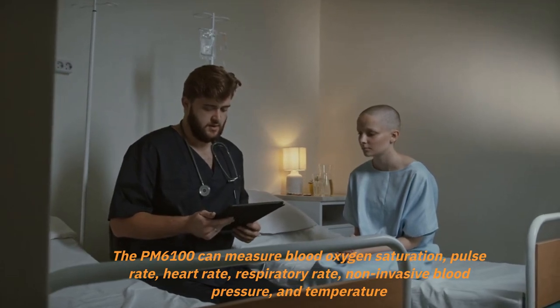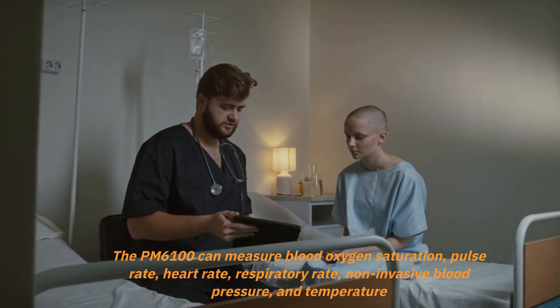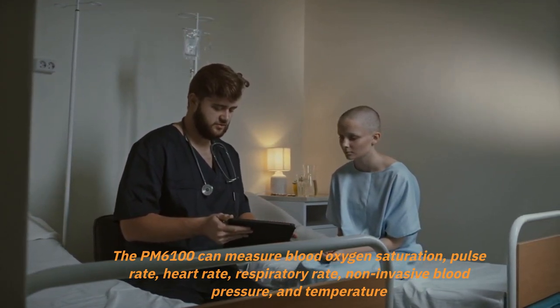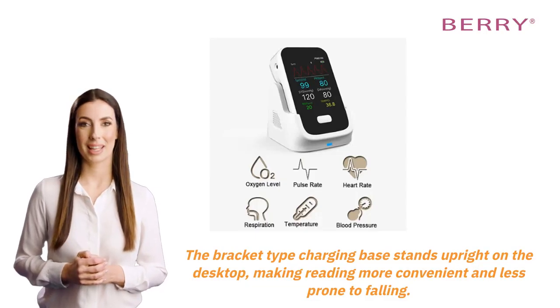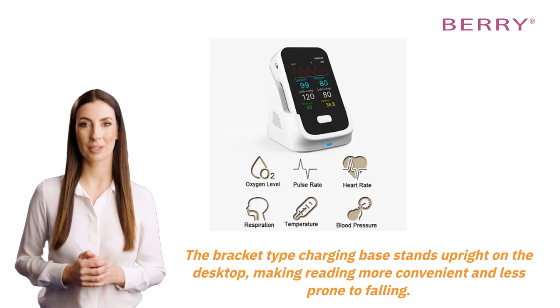The PM6100 can measure blood oxygen saturation, pulse rate, heart rate, respiratory rate, non-invasive blood pressure, and temperature. The bracket-type charging base stands upright on the desktop, making reading more convenient and less prone to falling.